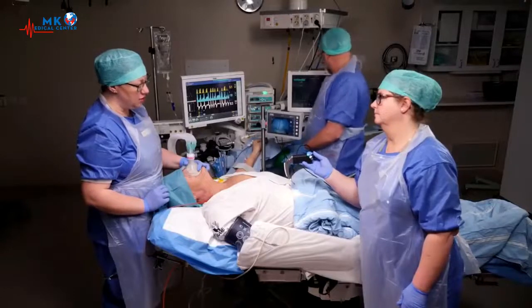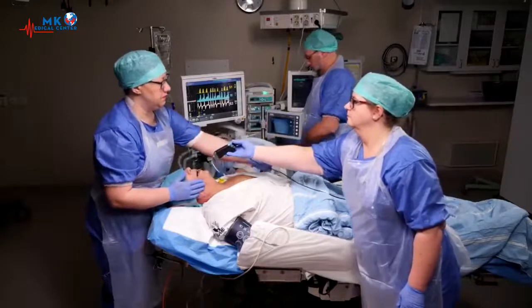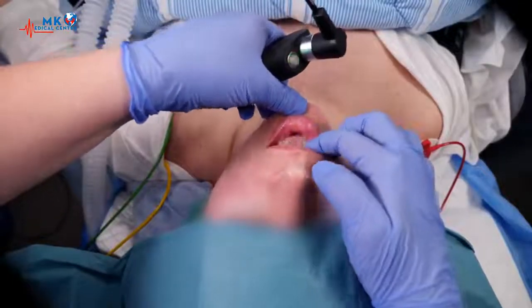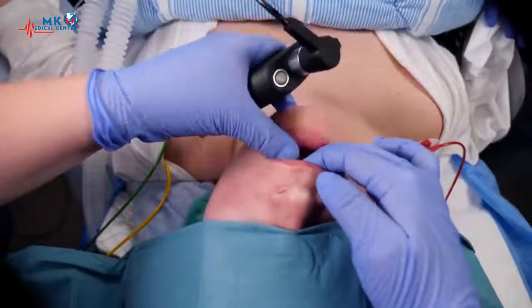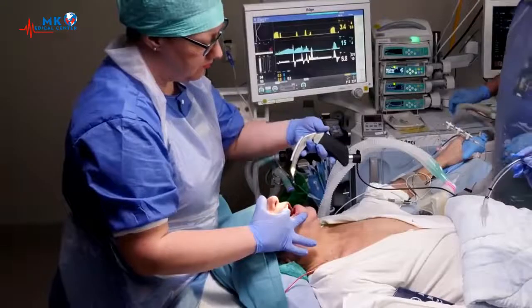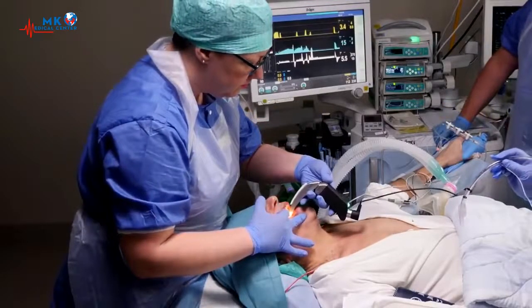Do not forget that while you may hold the blade, this is very much a team effort. Open the patient's mouth with your right hand and hold the laryngoscope in your left. Not too tight, with 3 or 4 fingers as close to the blade as possible for precision and control.